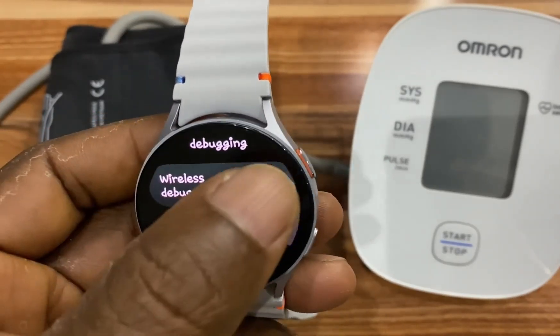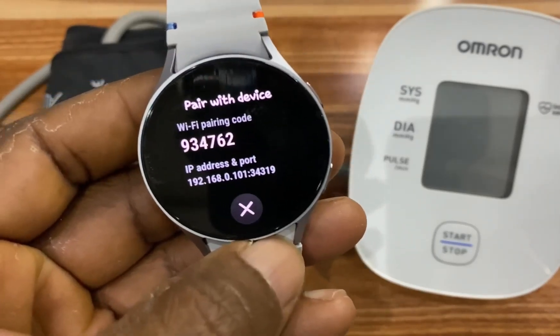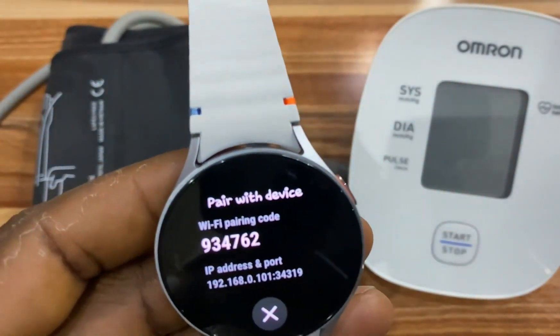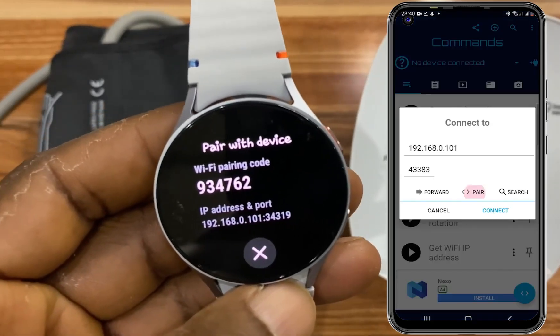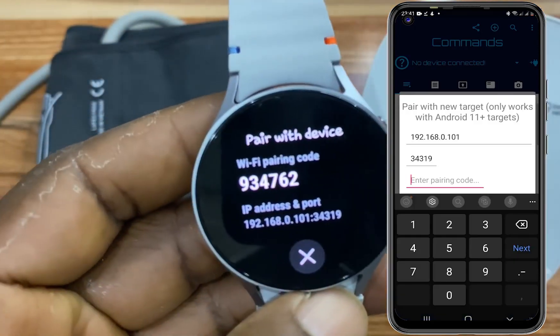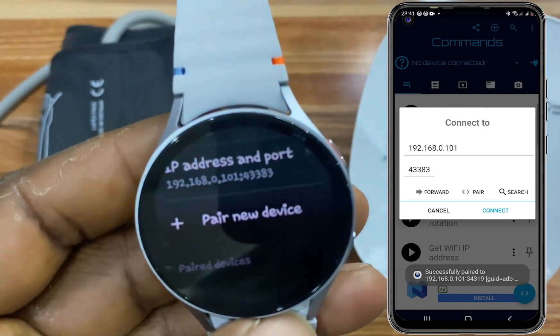With wireless debugging enabled, scroll down to where it says Pair New Device and tap on it. You need to enter these details on the BugJogger app. Go to the BugJogger app and tap on the plug icon at the top right-hand corner, tap on it, and tap on Pair. Enter the IP address, then the port, and then the pairing code. Once you're done, tap on Pair. This is successful as you can see on the BugJogger app.